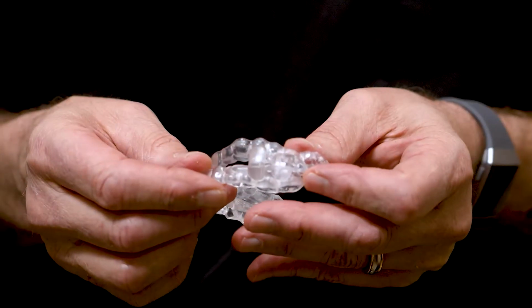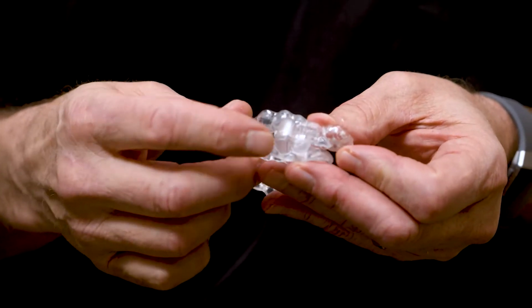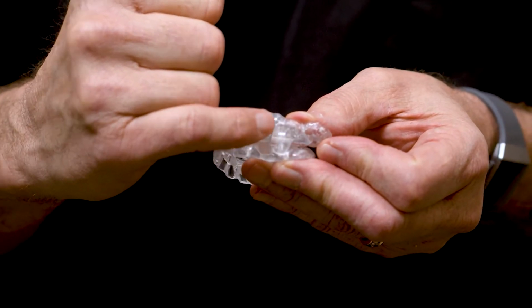And the way you change the arch to advance it a little bit is not to turn a screw or put a wrench on something or change a strap. Instead, it's simply taking one arch away and replacing it with another arch where the posts will actually be in the same spot, but the platform has moved forward 1 millimeter. Could be a half millimeter if that's your advancement protocol. The idea is we iteratively advance the mandible towards therapeutic position.